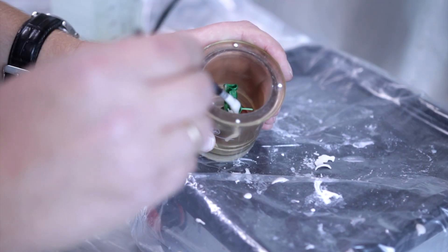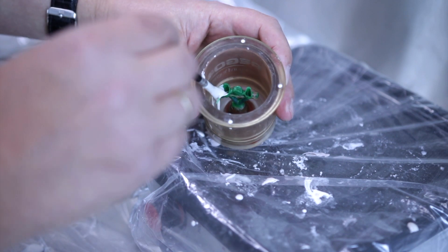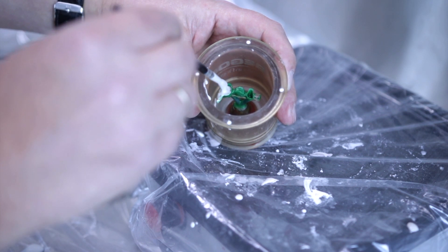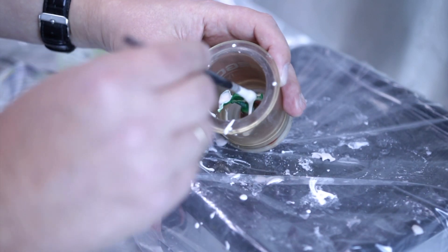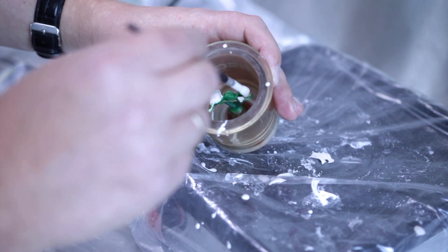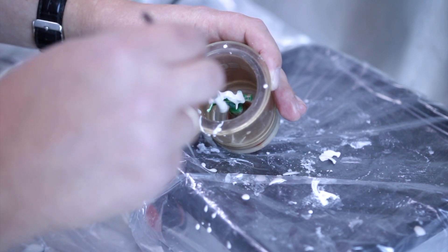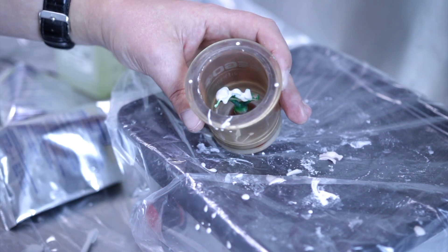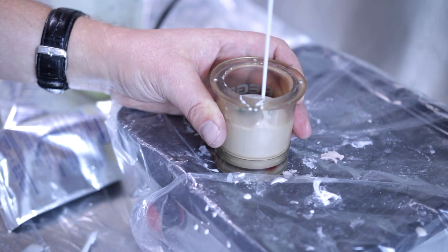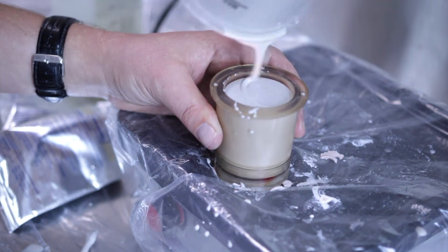Invest carefully by using an instrument so you don't get porosity inside the framework. Allow the desirable setting time, then place the ring in a burnout furnace at 850 degrees Celsius for 45 minutes.